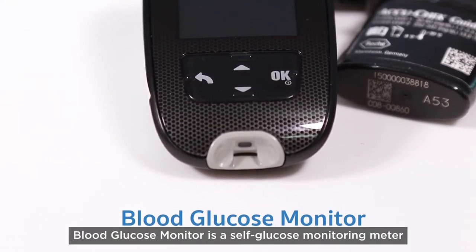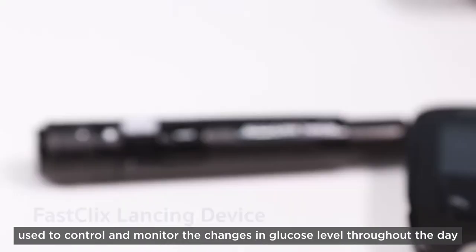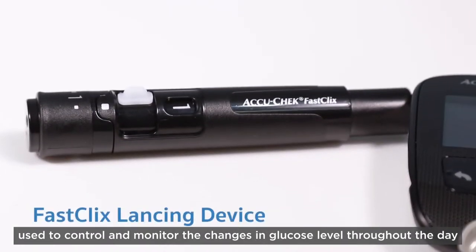The blood glucose monitor is a self glucose monitoring meter used to control and monitor the changes in glucose level throughout the day.